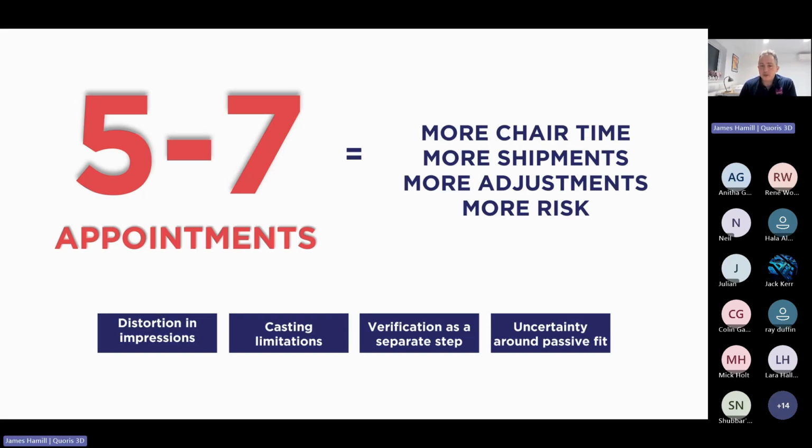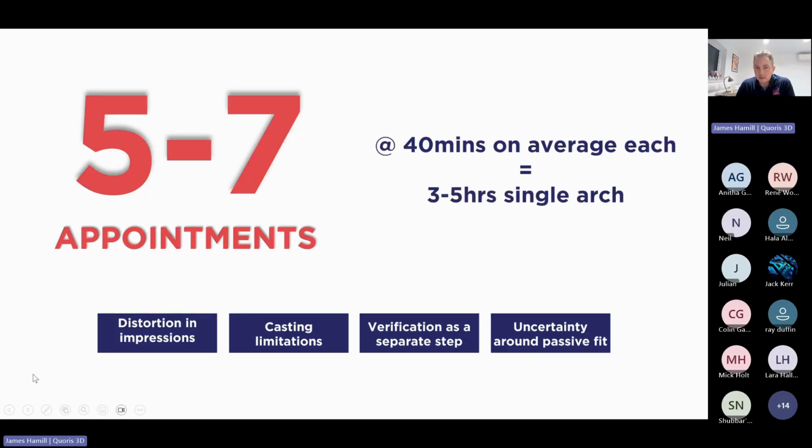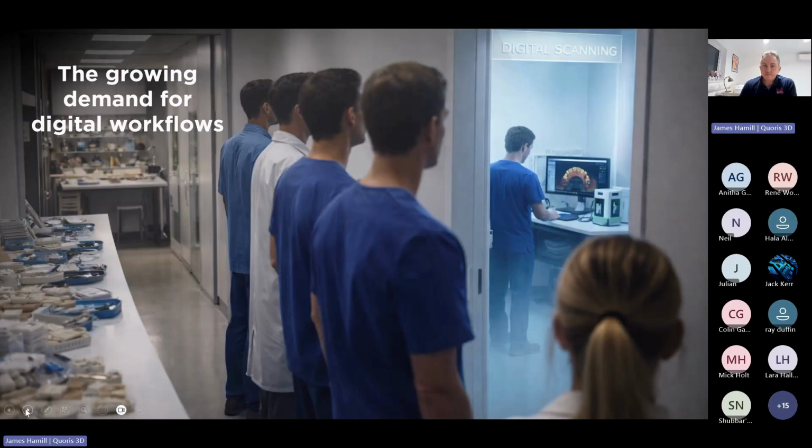And ultimately that created a reasonably time-pressured and long-winded way of restoring these cases, often taking anything between 3 and 5 hours just to restore a single arch, because most of these appointments are going to be between 40 and 60 minutes long. Okay, so that was typically how things were done. And as I've said, I've been amazed at the courses that we have run in our premises here, just how many people are still actually working in this way.